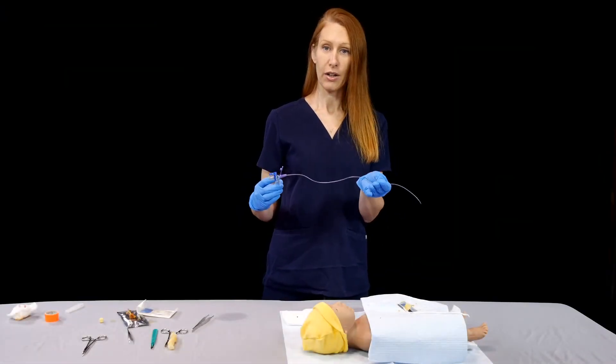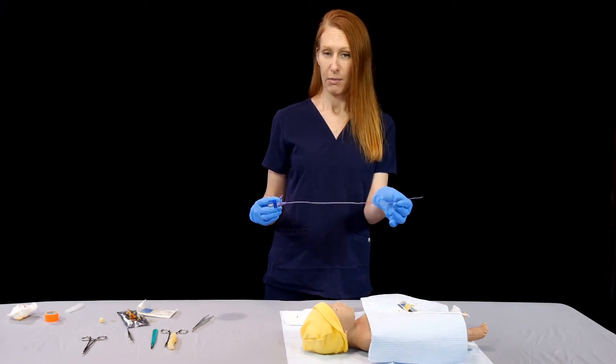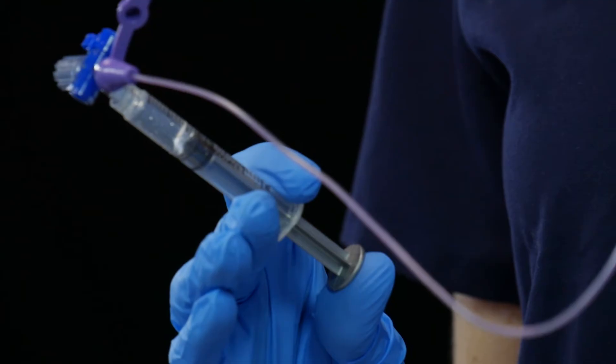Next, we're going to prepare our umbilical line or feeding tube by flushing it with saline.